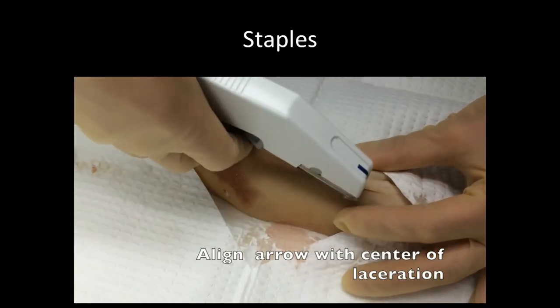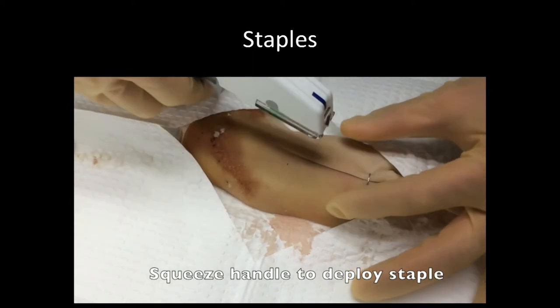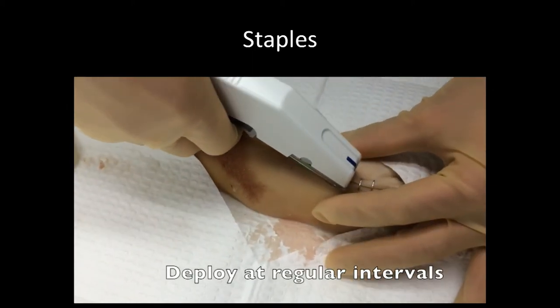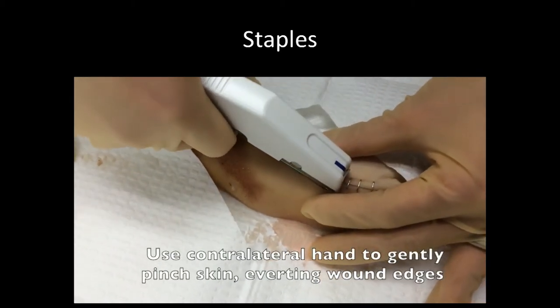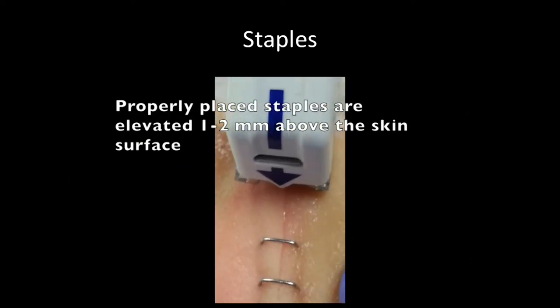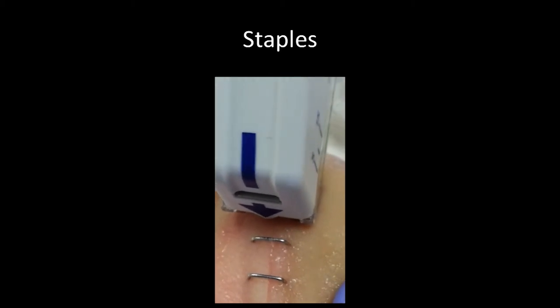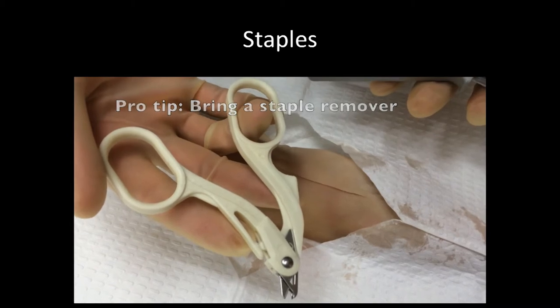Firstly, you want to align that arrow with the center of the laceration. You'll then place the stapling device on the wound as you use your fingers to pinch the edges of the wound to evert the edges. You want to deploy those staples at regular intervals and walk your hand down, everting the edges as you go. Now, properly placed staples should be elevated about 1 to 2 millimeters above the skin surface. And this is so that when you remove the staples, they're easier to get out.